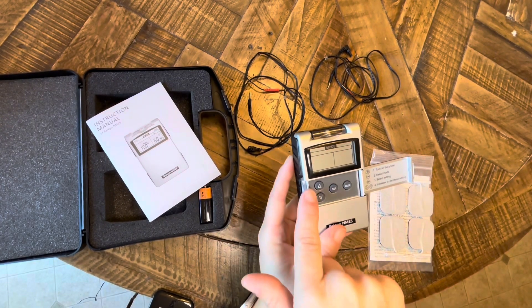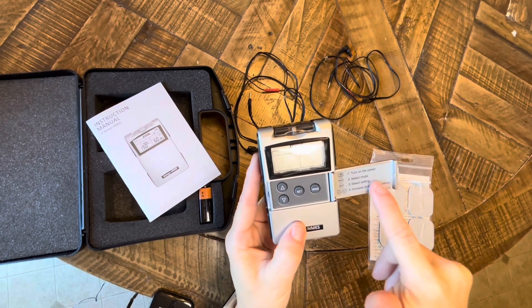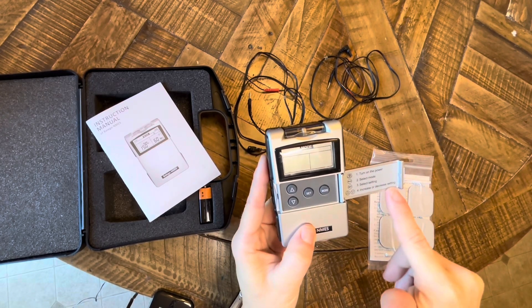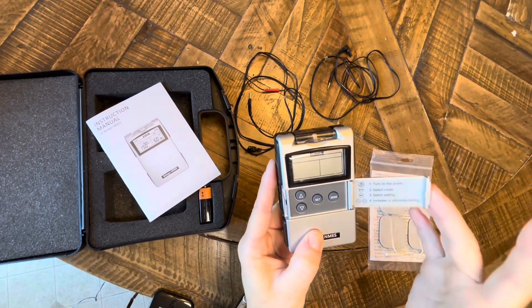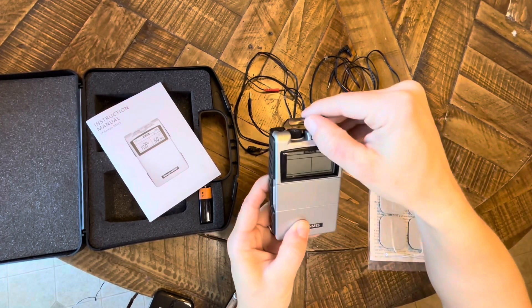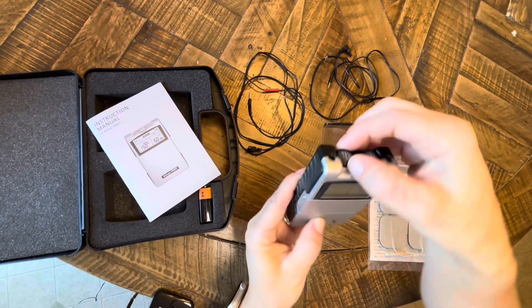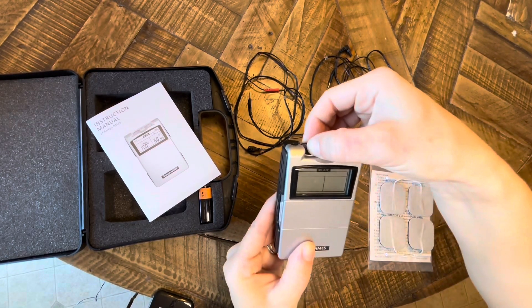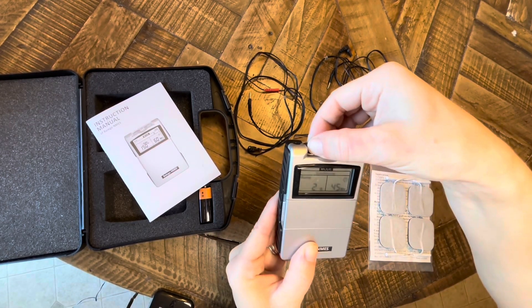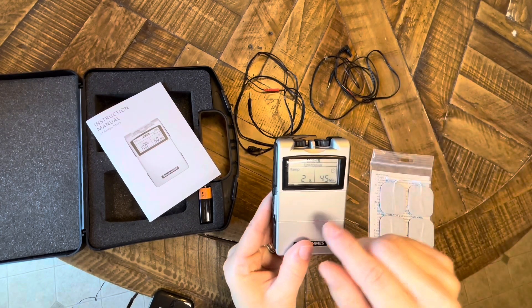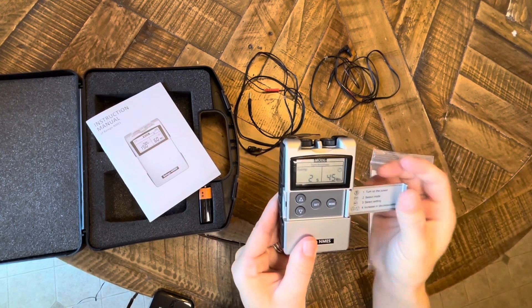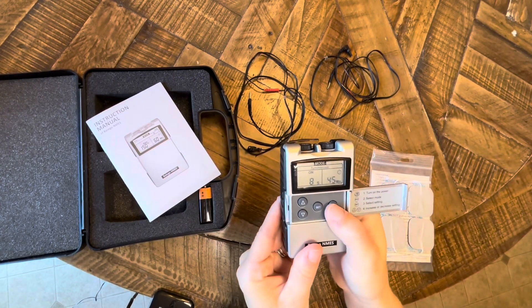The front panel is where you can set all your parameters. The top part is the dials for turning up the amplitude intensity. You also need to turn the dial just a little bit to actually turn it on, and then once it's on you can open up that front panel.